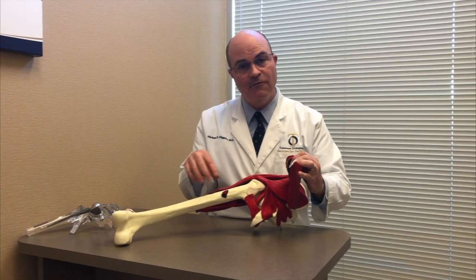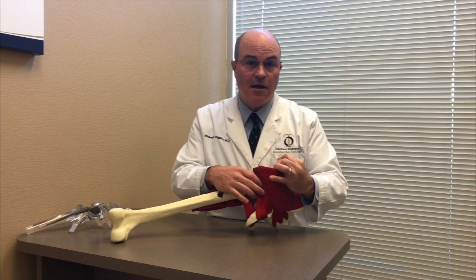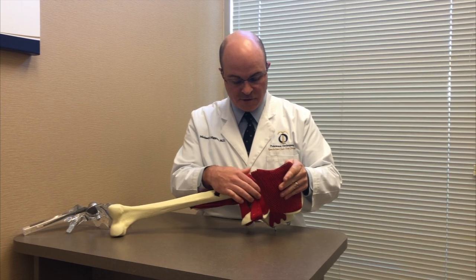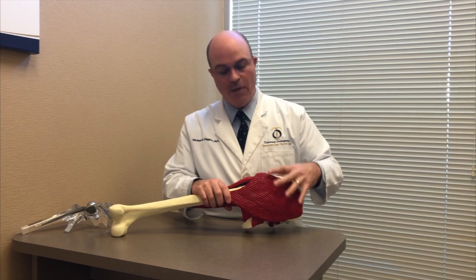Those implants I showed at the beginning of the video are then put in. What that leaves you with is a lot of pain and a lot of weakness, because there's been a lot of damage to muscles. At the end, these muscles are sewn back in place, so when you wake up you're going to have more pain and more weakness.